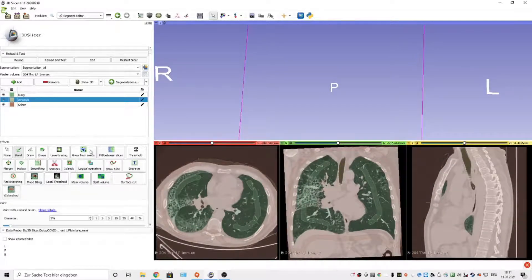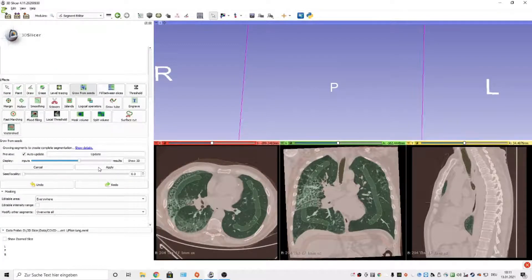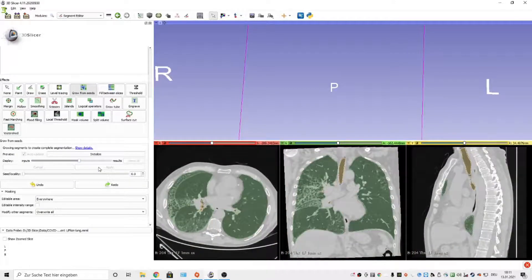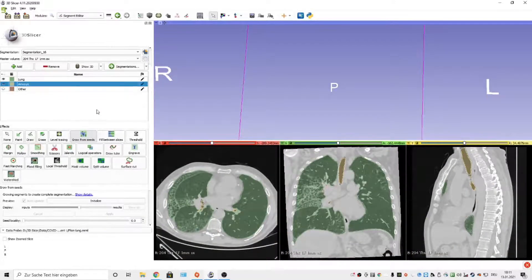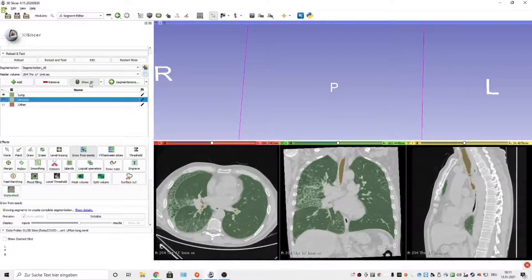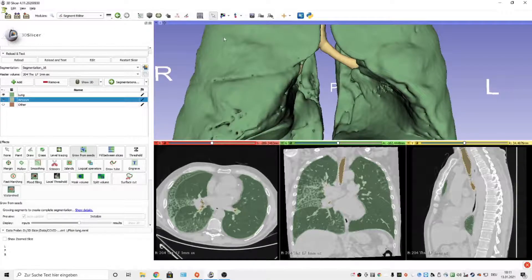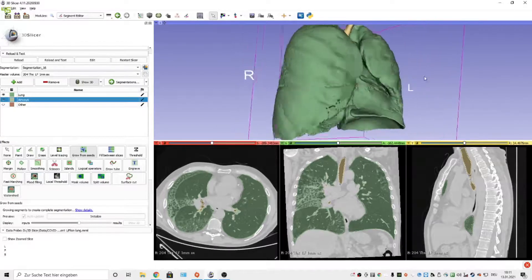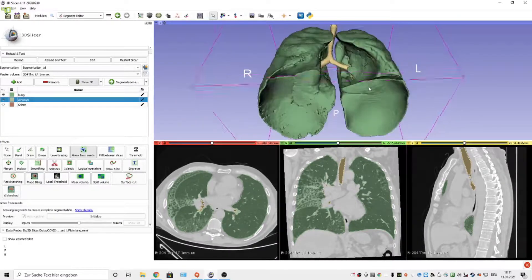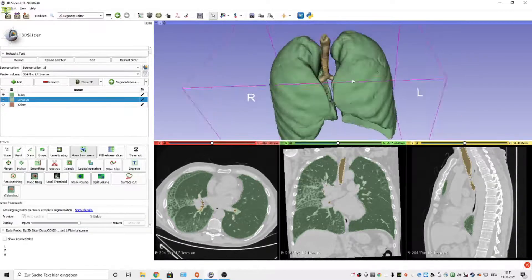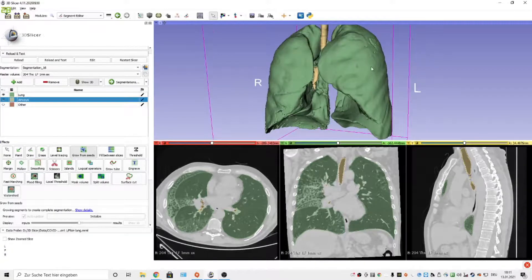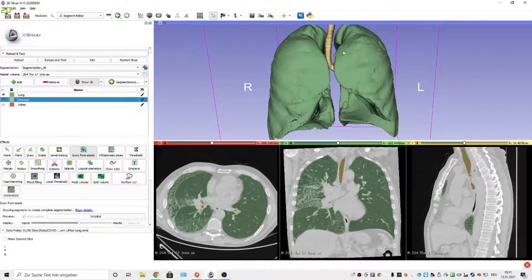In the end, you go to the Grow from Seeds function again and press Apply. To be able to see the result in the 3D view, you press Show 3D and have to wait for approximately 30 seconds. Okay, this is the view of the lung and the airways.